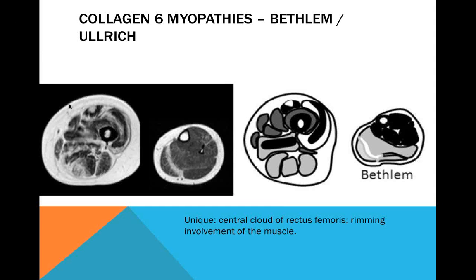So we're getting it from the outside in, the outside fascial layer, and also from the inside fascial layer there. You don't have that type of bipinnate distribution within the rest of the muscles in the leg here. The same is the case down here. I have seen rimming in the gastrocnemius muscles. I've seen rimming in the tibialis anterior muscle. There is a fascial plane here in the tibialis anterior muscle. I've seen a similar type of appearance there, where the fibrofatty replacement within the muscle tissue starts to come out right from there.